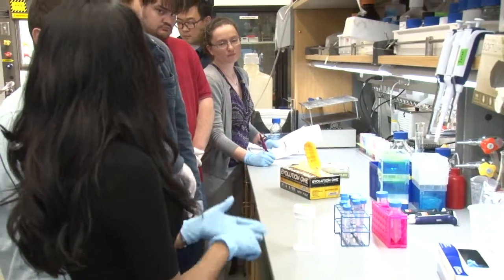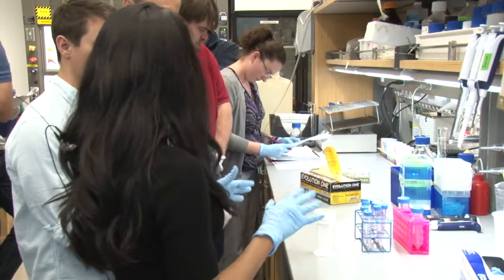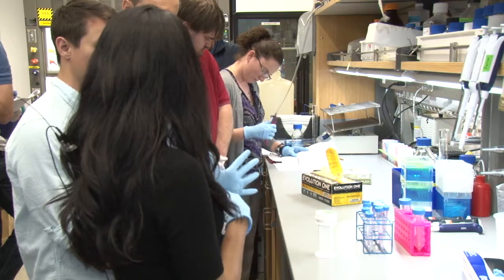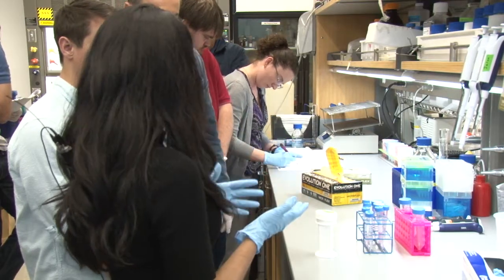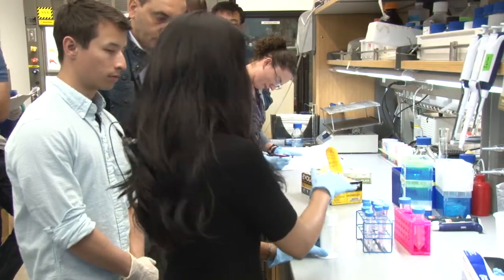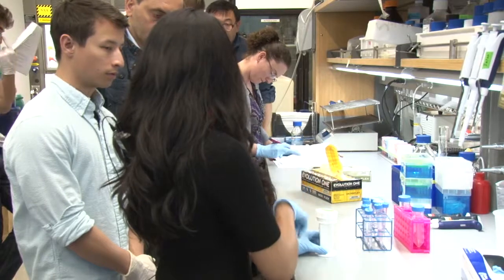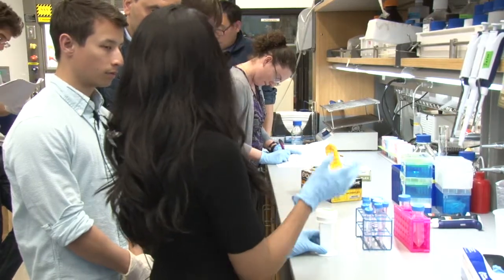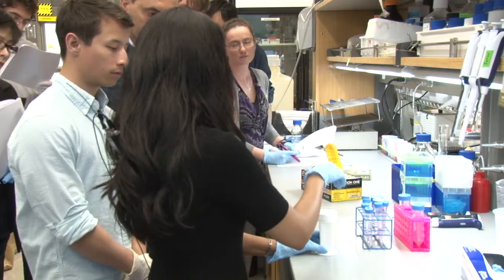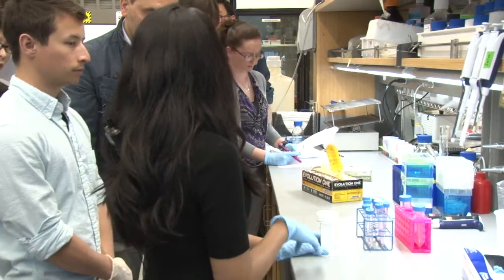This buffer has citrate and LDS. Citrate is commonly used for antigen retrieval. Along with this, we add LDS, which is lithium dodecyl sulfate — it's a mild detergent that makes antigen retrieval work better. You would prepare that buffer, and once the incubation is over, you would swap the PFA and add your antigen retrieval buffer.